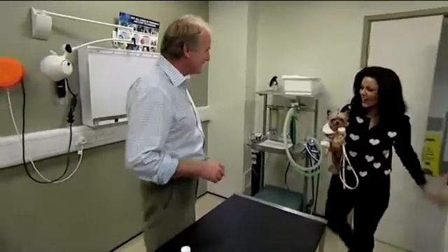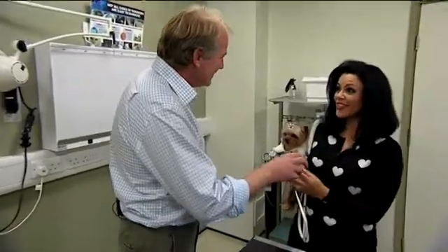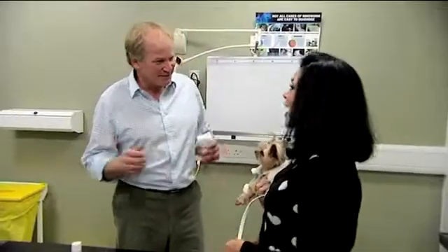Hi Louise, how did that go? Hello, it was really interesting actually. Easy, difficult? It wasn't difficult, it was easier than I thought.